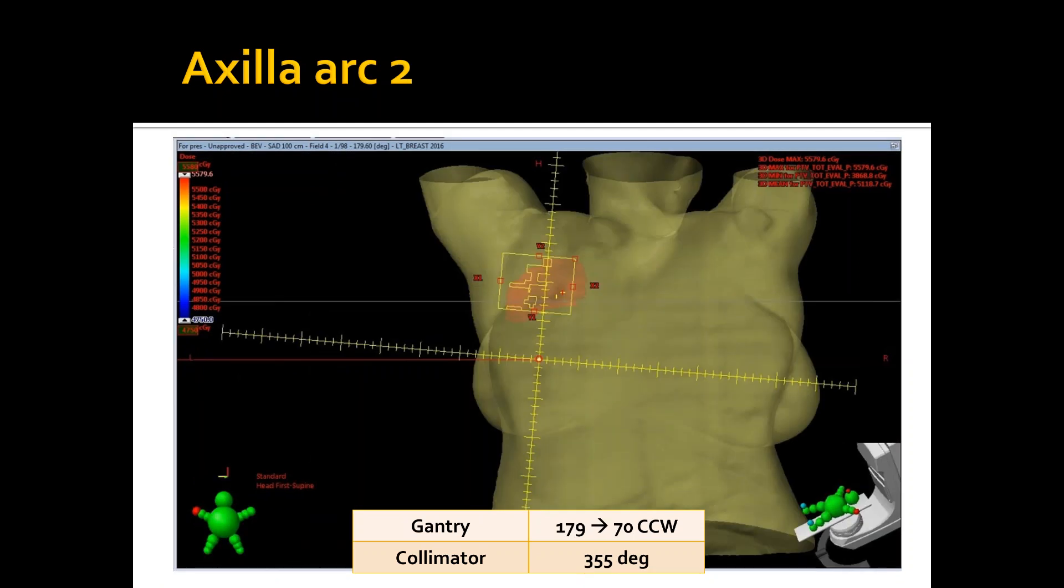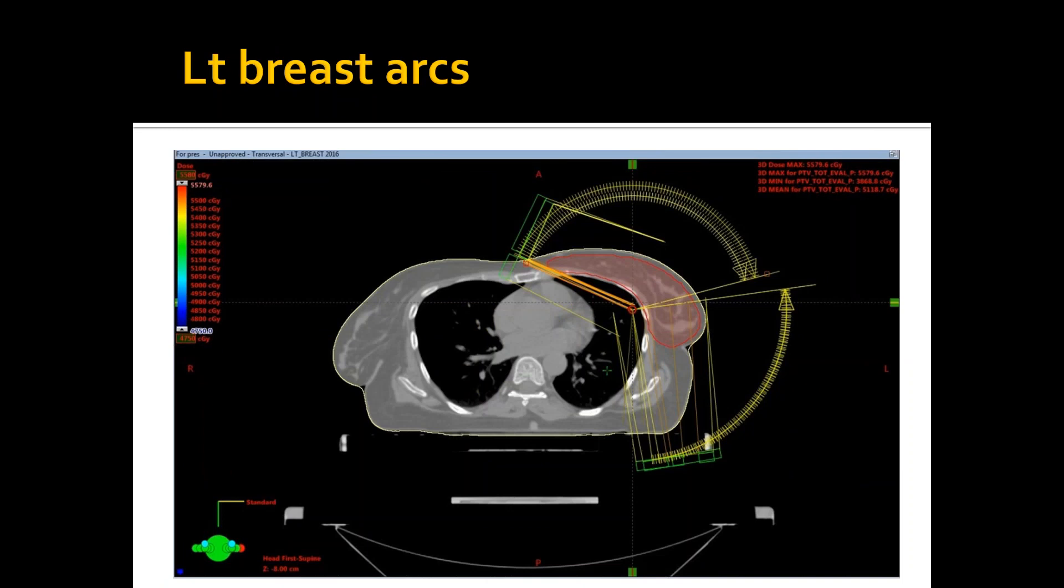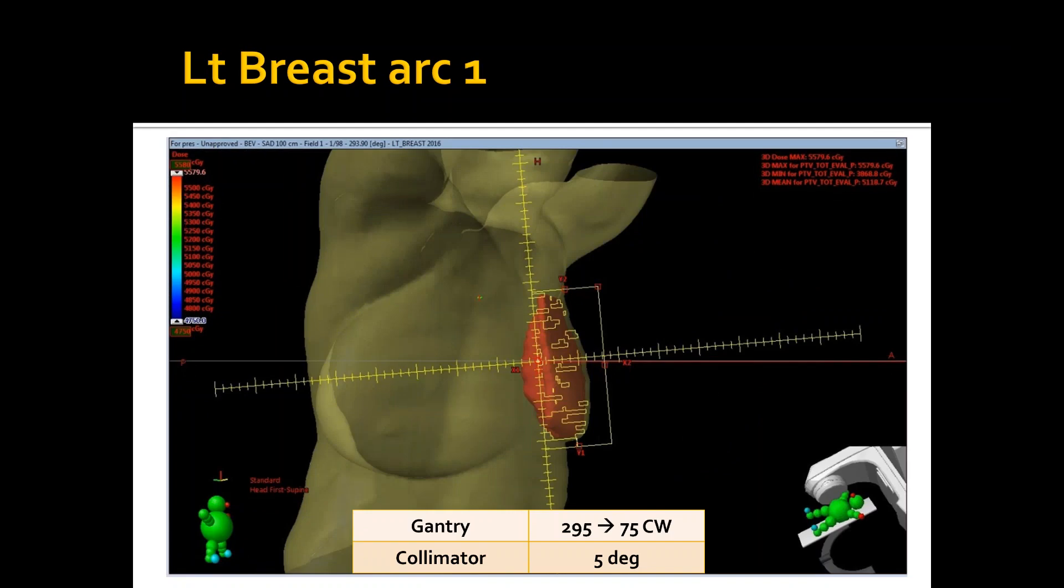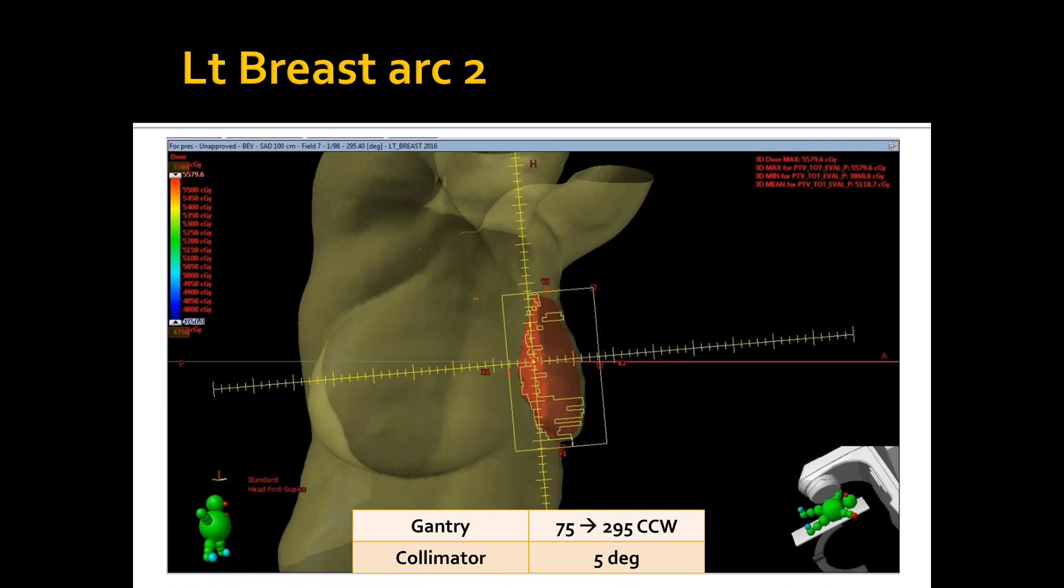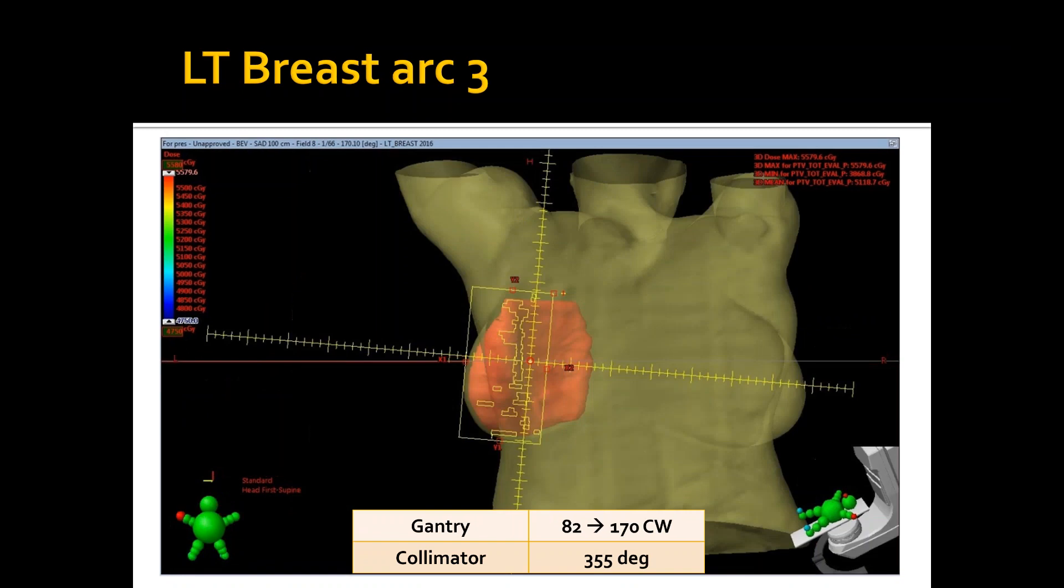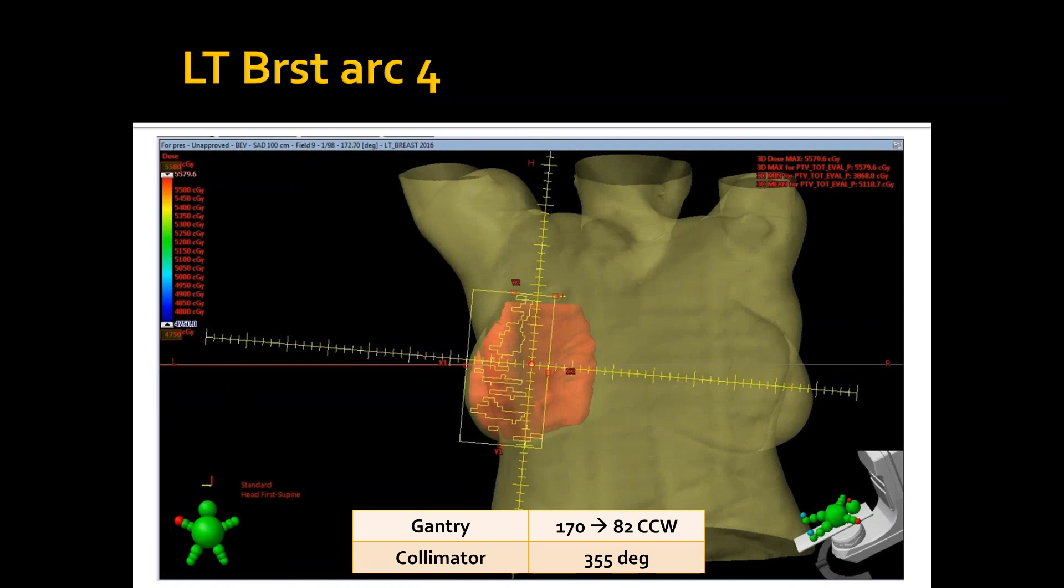And for the left breast, I used actually four partial arcs this time. And this is just to give the optimizer more flexibility because the left breast is the largest target in our case. And I just gave it four arcs to be more flexible. This is the first one with the half beam block from 295 to 75 clockwise. The second one is the same, but I opened the X jaws a little bit more just to give the system more flexibility to find more solutions. And this is the third and fourth arcs. They're identical arcs with different rotation directions.